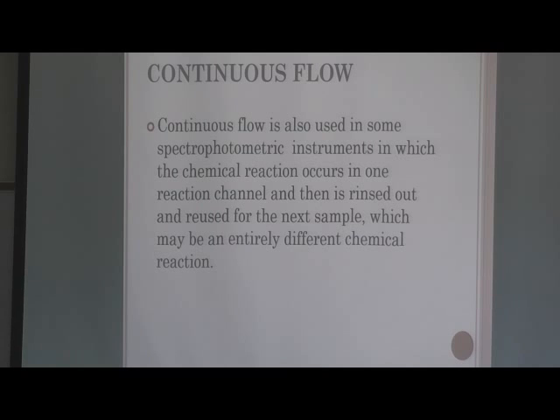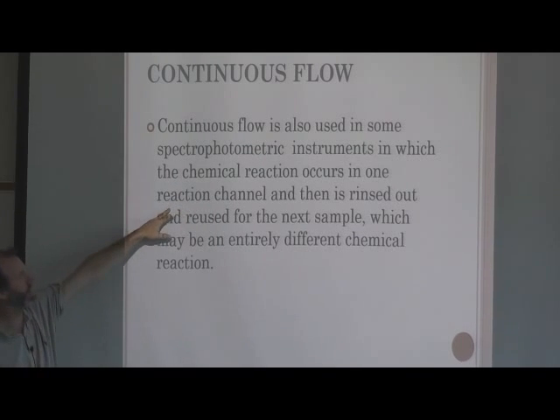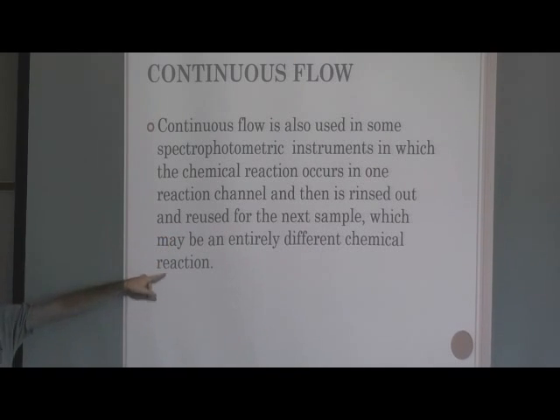So it's used on some spectrophotometric instruments in which the chemical reaction occurs in one reaction channel and then is rinsed out and reused for the next sample, which may be entirely different chemical reactions.